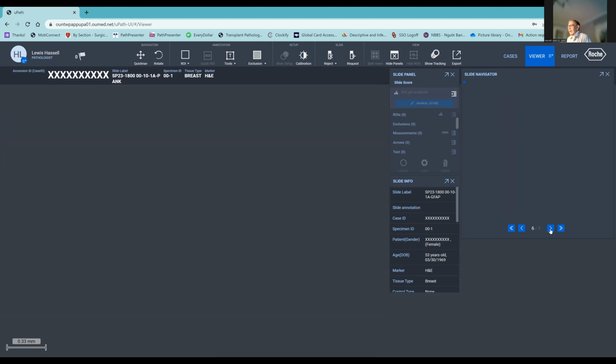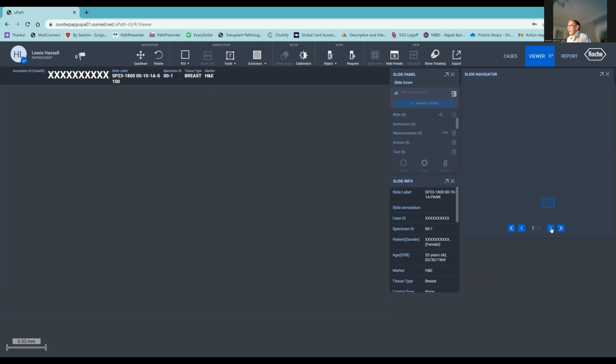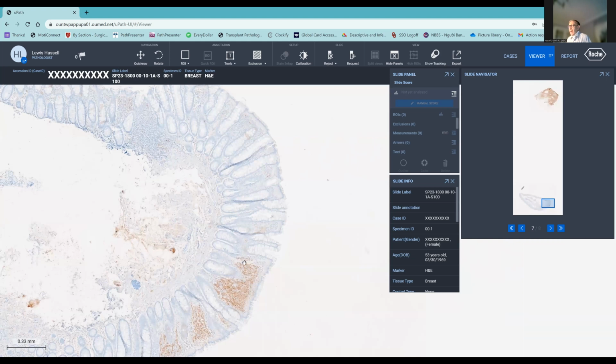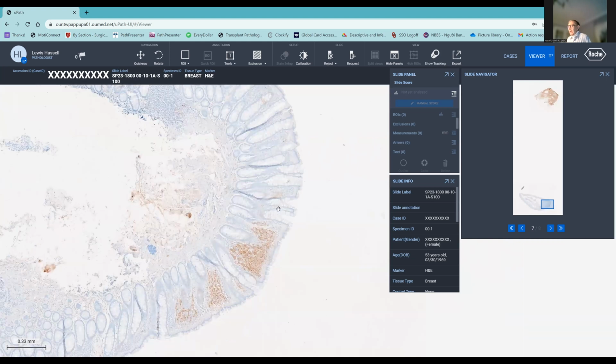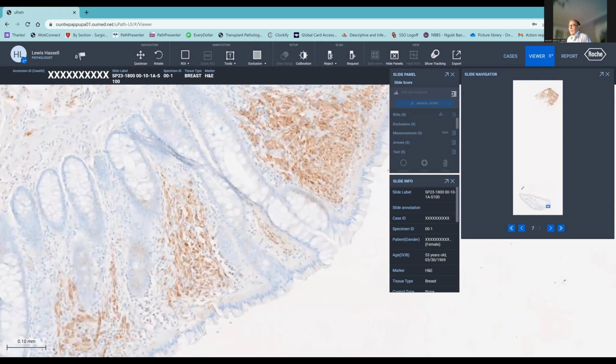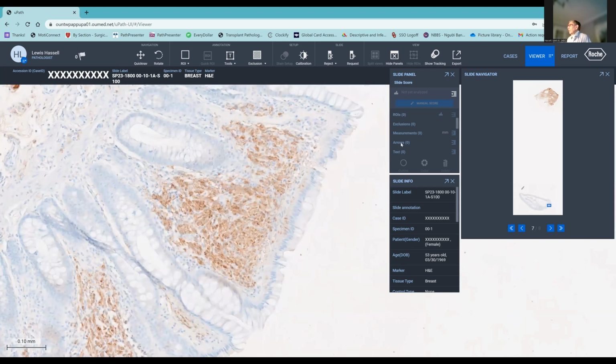And so we get down here to another keratin. I think we'll skip this one and go directly to, ta-da, the stain that seals the diagnosis. Here you can see that our lamina propria is nicely expanded by S100 positive cells, confirming that this is indeed a mucosal Schwann cell hamartoma.